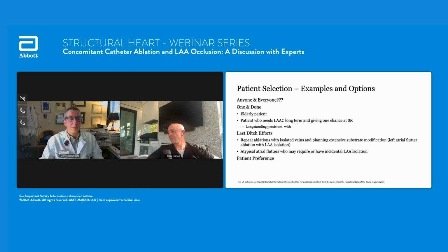Yeah, I was going to say, with the patient preference thing, I'm still kind of a stickler for, I want to see an indication for LAA on its own. And so, now it's not really a bona fide indication change or covered for the sort of stable CHAMPION type patient. We do want to see the data from those studies, but OPTION certainly gives you some hope that's going to look quite favorable. So even without those patients, I'm still looking at 15, 20% of my ablations being concomitant. I would think it's probably going to shoot to 50% by the time those trials come out.